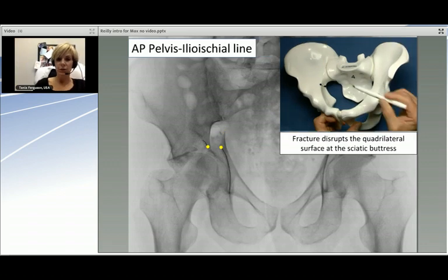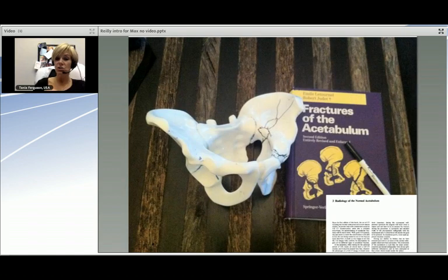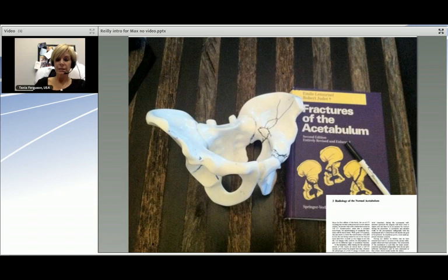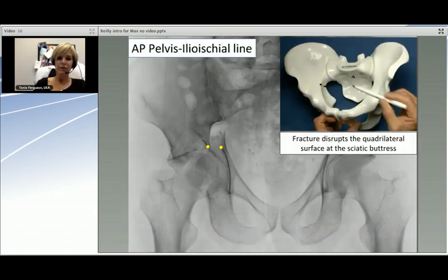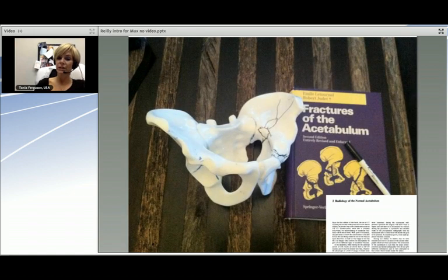Moving on to the ilio-ischial line, a representation of the quadrilateral surface, we'll be able to take the seen injury on the radiographs and apply that to our three-dimensional model. Dr. Riley is going to take about 35 to 40 minutes to take this fairly complicated radiograph and translate all of the films — not only the AP pelvis, but the obturator and iliac oblique — and learn to use the CT scan to confirm what we've already drawn and better understand the articular injury.